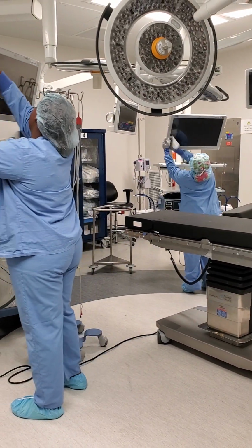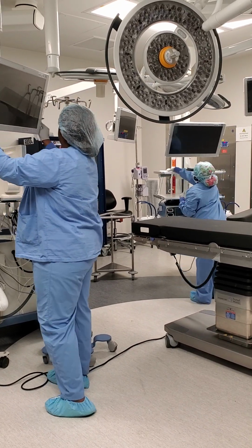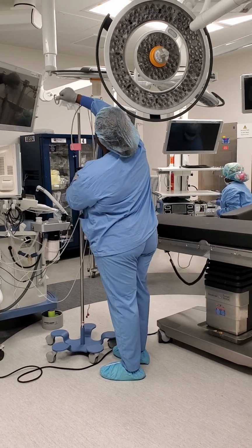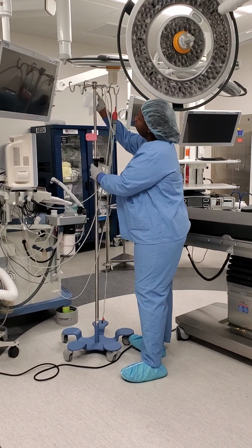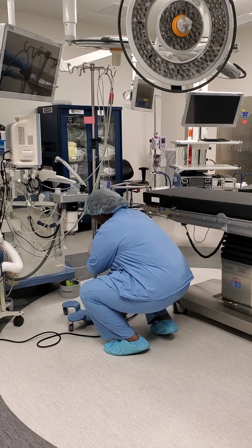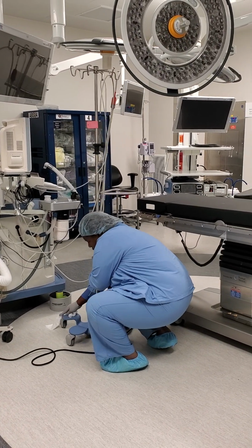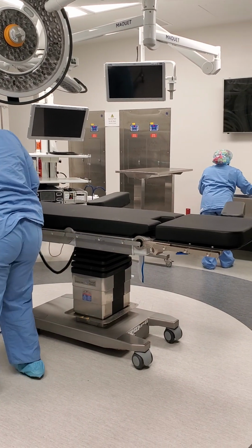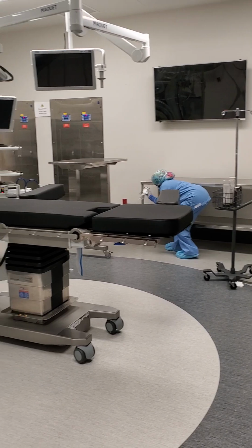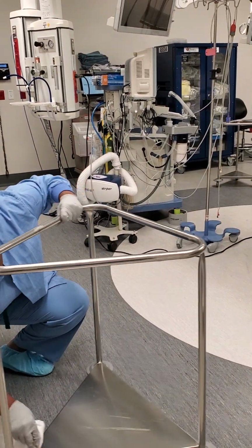We want to make sure to work from the top to the bottom of the room and from the outside of the room to the inside of the room, cleaning all flat surfaces. Next, we'll do the IV poles. Make especially sure that there is no blood on the feet of them. Once all the high items have been cleaned, we will start at the outside of the room, cleaning all of the tables, including the legs, and making sure that all of the trash liners are wiped down.